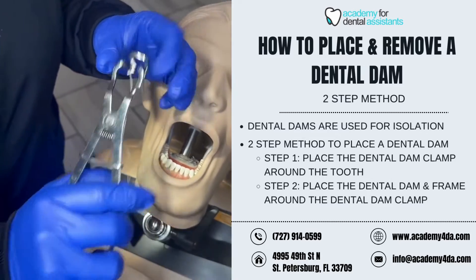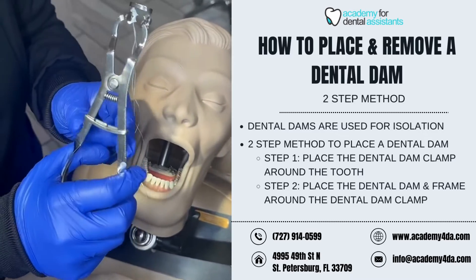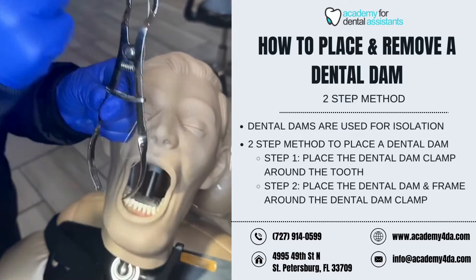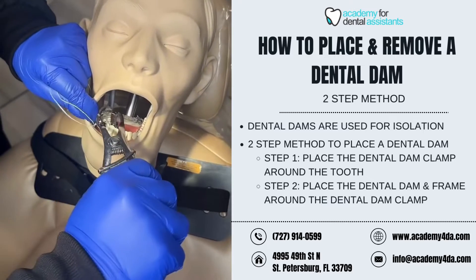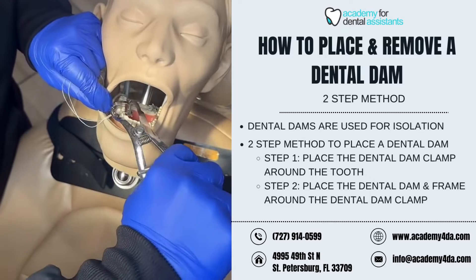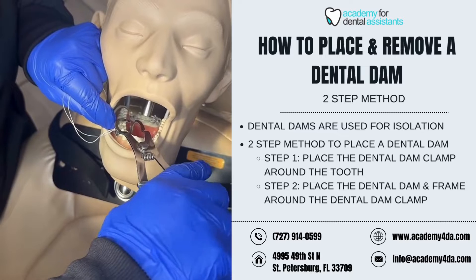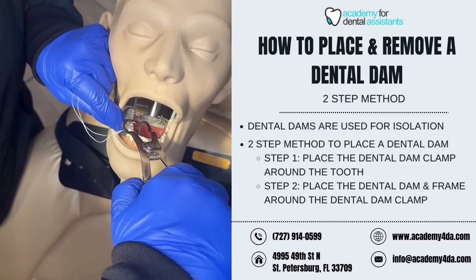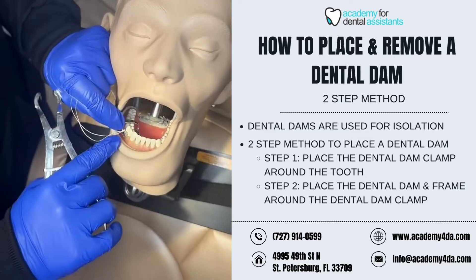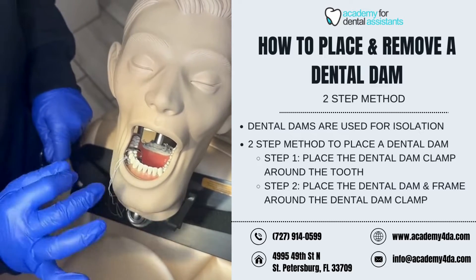I'm going to squeeze my dental dam forceps — as you can tell, it's going to widen the clamp. I can use the locking mechanism to lock it in place so I don't have to hold it. The tighter I squeeze, the wider it opens. When I fit this around the tooth, I'm going to place it right along that gingival margin, let go, and disengage the locking mechanism so it sits right along that gingival tissue — not resting on the gums, but right above.